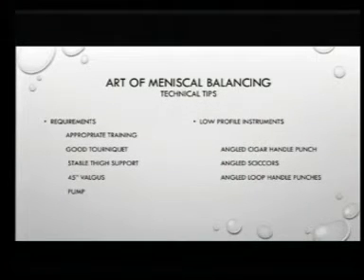So, to do a good partial meniscectomy and balance the meniscus properly, you need a good tourniquet, a stable thigh support, wherein you can actually lever out the knee to about 45 degrees. In tight knees and posteromedial corners, a pump most often helps.